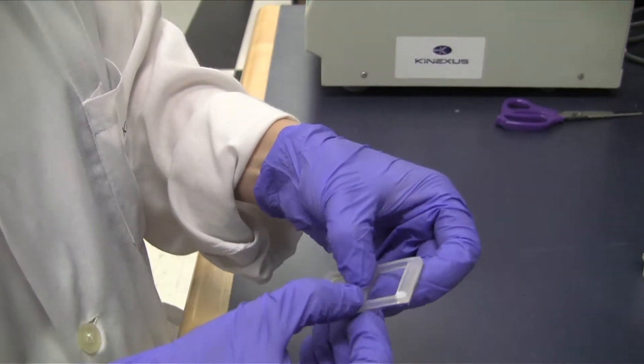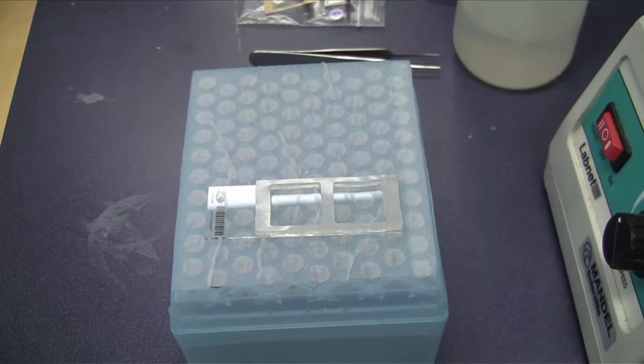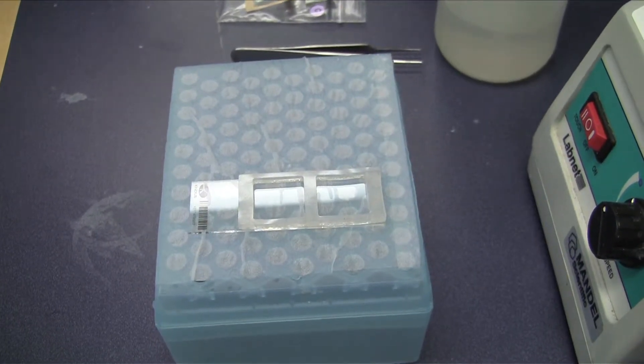Carefully position the chamber so the outer boundaries of its wells are aligned closely with those of the microarray and away from the end containing the barcode and logo.